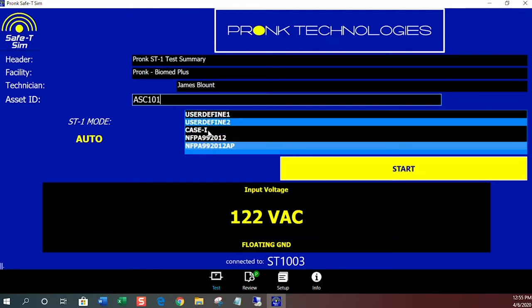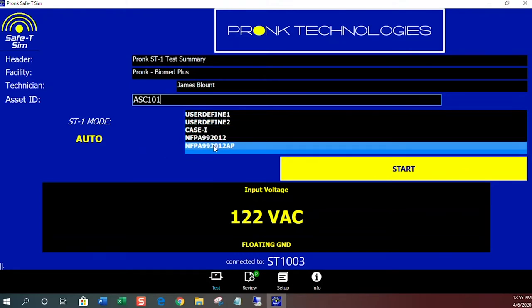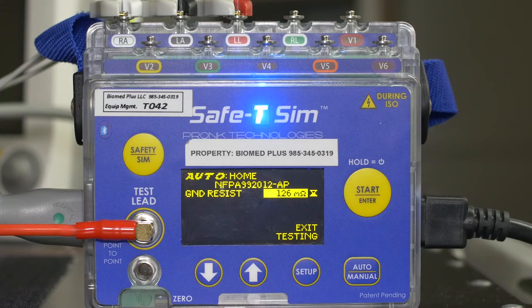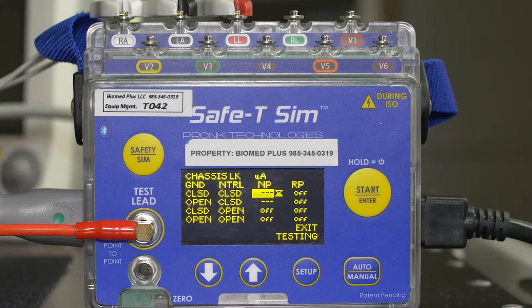For this example we're going to use the NFPA 99 2012 AP or applied parts mode. From there you click the start button and the test sequence will begin. The first test up will be the ground resistance test, and it'll automatically proceed to the next round of tests, flashing a green LED when the test passes, or it'll stop and alarm and flash a red LED for any failures you may encounter.